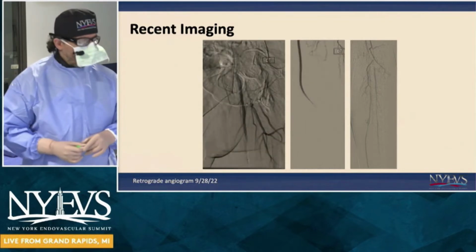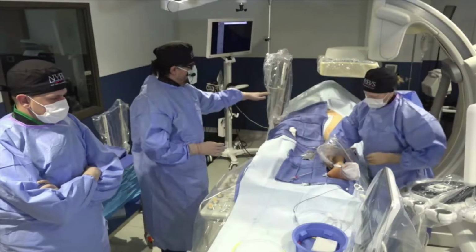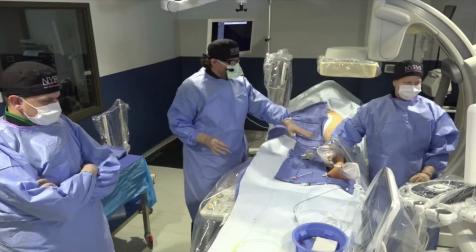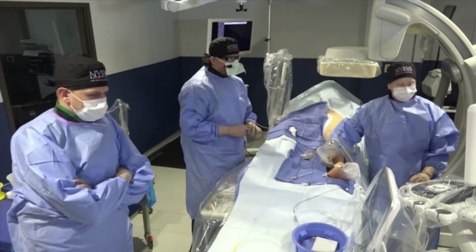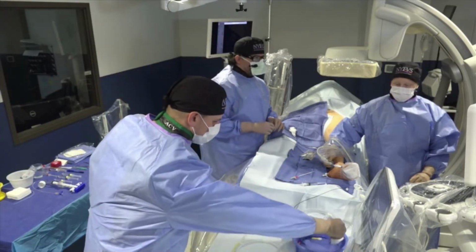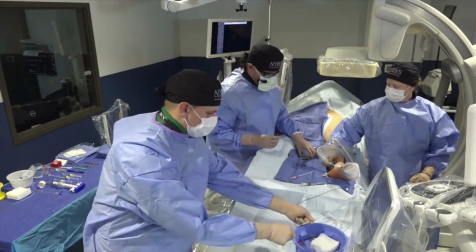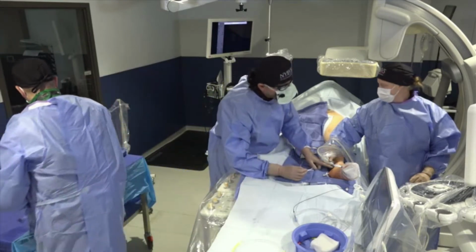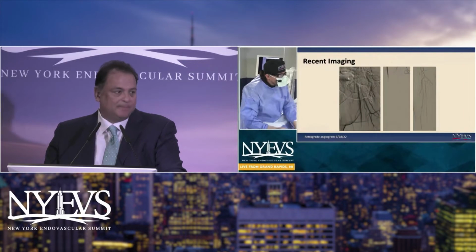I'm going to stop here. I just want to point out to PK that our patient is in what we call position number 1. So the right groin is available. The left leg is completely exposed, as you can see, to have access to our interventional ultrasonography. So I'll stop here, PK, and see what you guys would like us to do. Yep. I mean, Fadi, you got a great panel here, and I'm just going to turn to the panel and ask Darren what his thoughts are about the angiogram and what his approach would be.